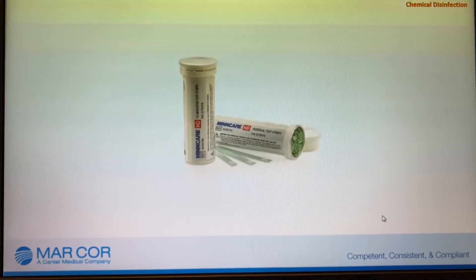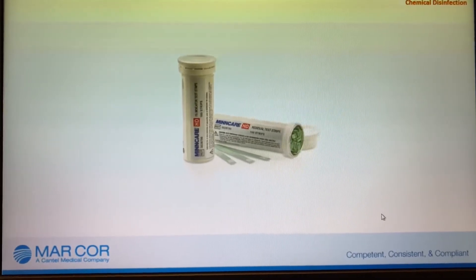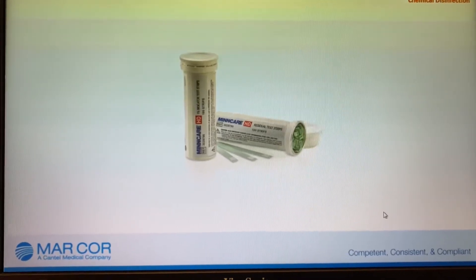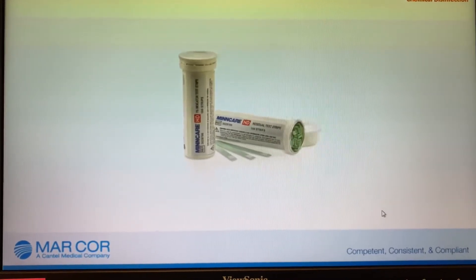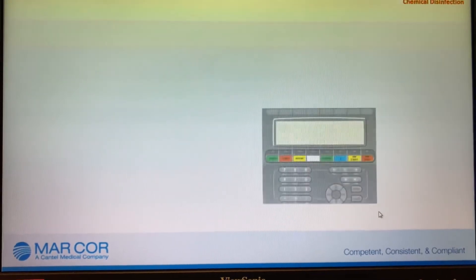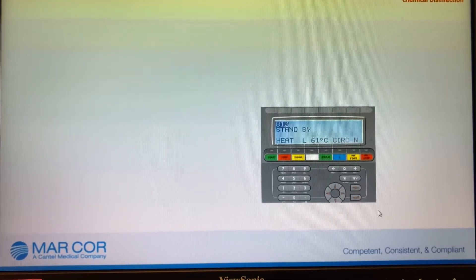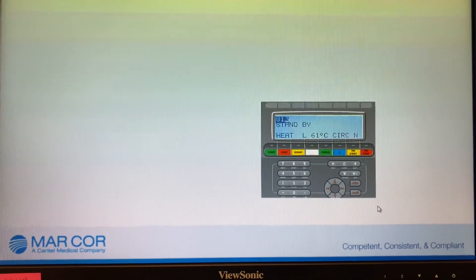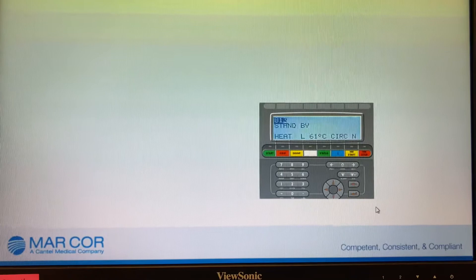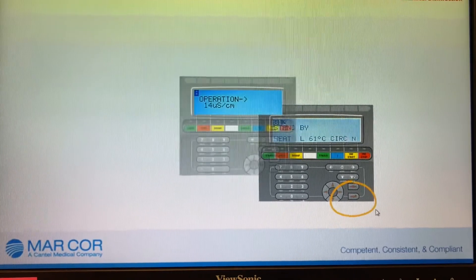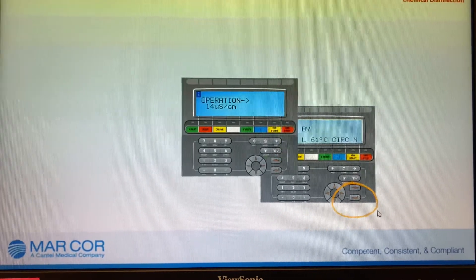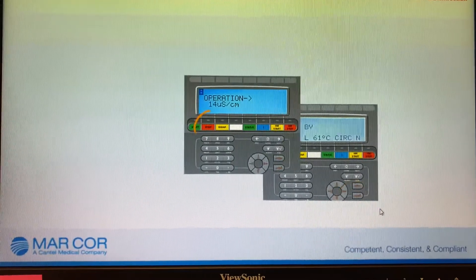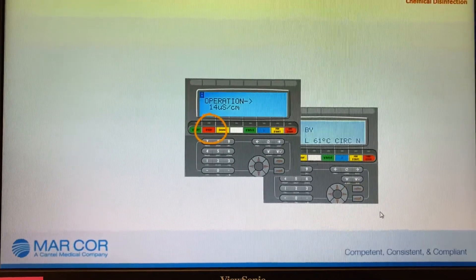MinCare HD test strips provide quick results with easy-to-read indicators. Enter the operator's code 813 and press enter. Once the water is free of disinfectant, press stop.